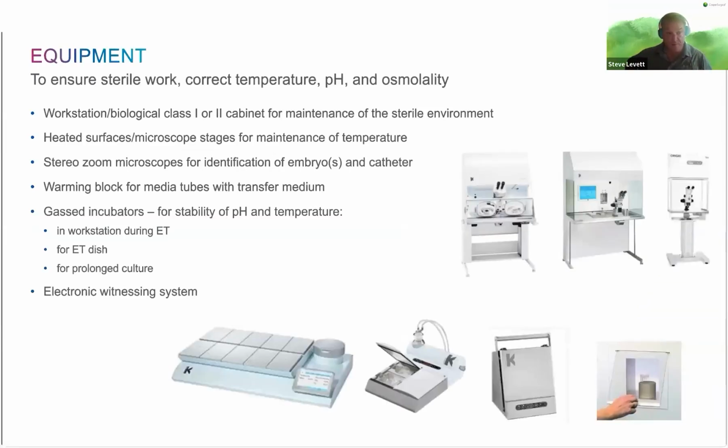If we talk about the equipment that we see and use for embryo transfer, no different from everything else in the embryology lab and in culture, we need to use the best quality equipment. It needs to be set up and mapped in the right way. It needs to be maintained and serviced so that we are working under optimal conditions.